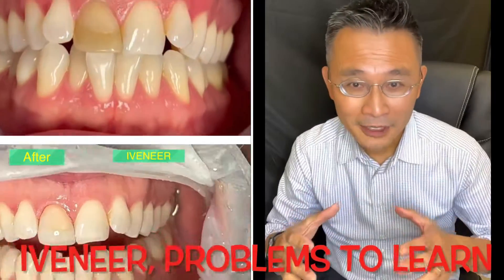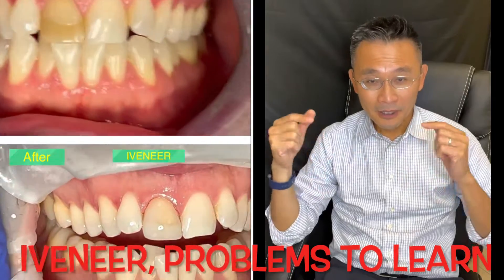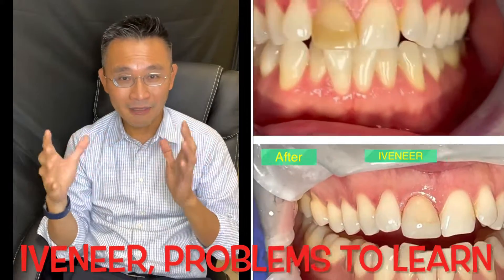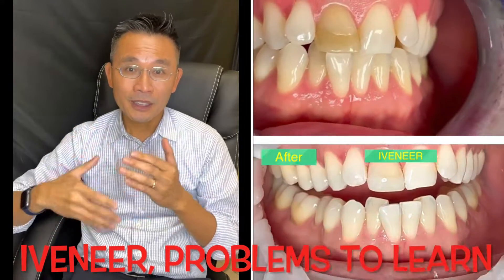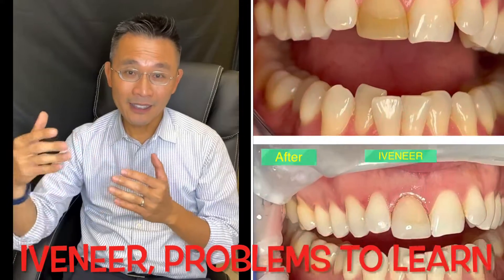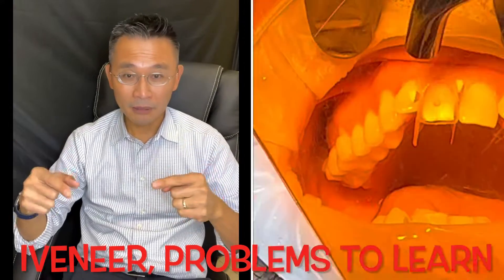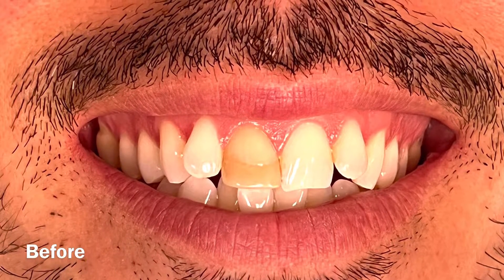Hey guys, welcome back to my YouTube channel. Today I will walk you through this particular iveneer case. I'm not saying I did a great job — I'm saying I had a problem with it, and I want to teach you and share the mistakes I made. I hope it helps. If you're about to do an iveneer, I want you to check this out and learn from my mistakes.